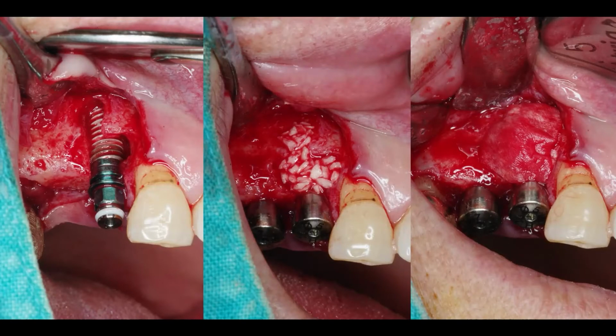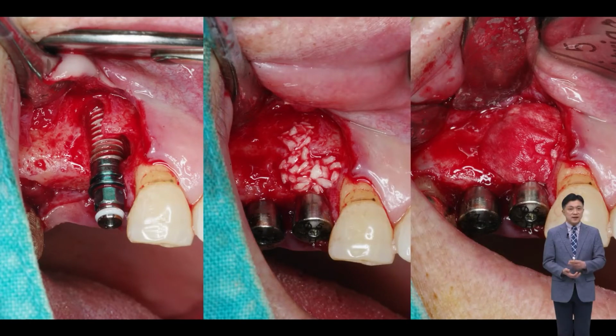In this case, I placed it deep, 3 millimeters from the proximal bone crest of the adjacent tooth. The implant is placed, bone graft is done, healing abutment is connected, collagen membrane is used to cover it, and surgery was completed.